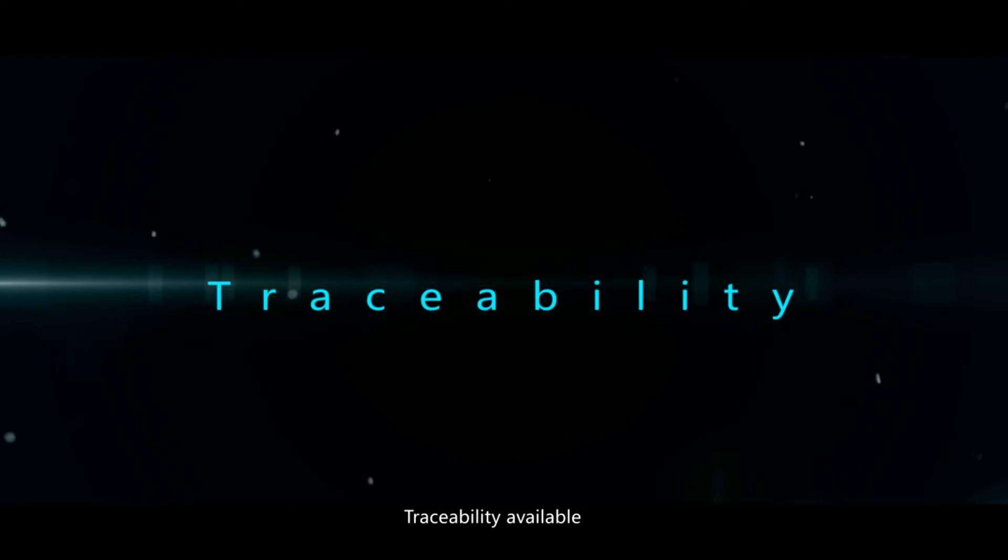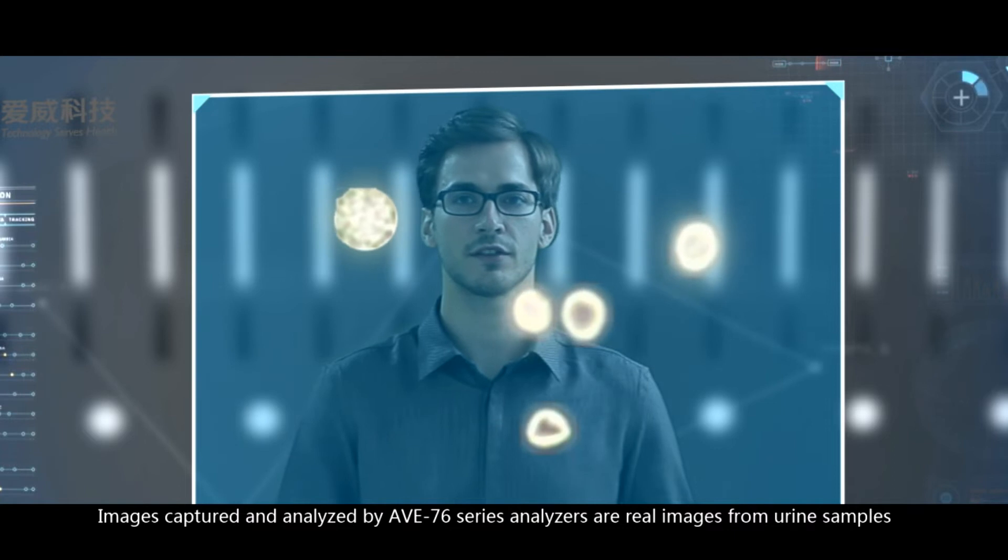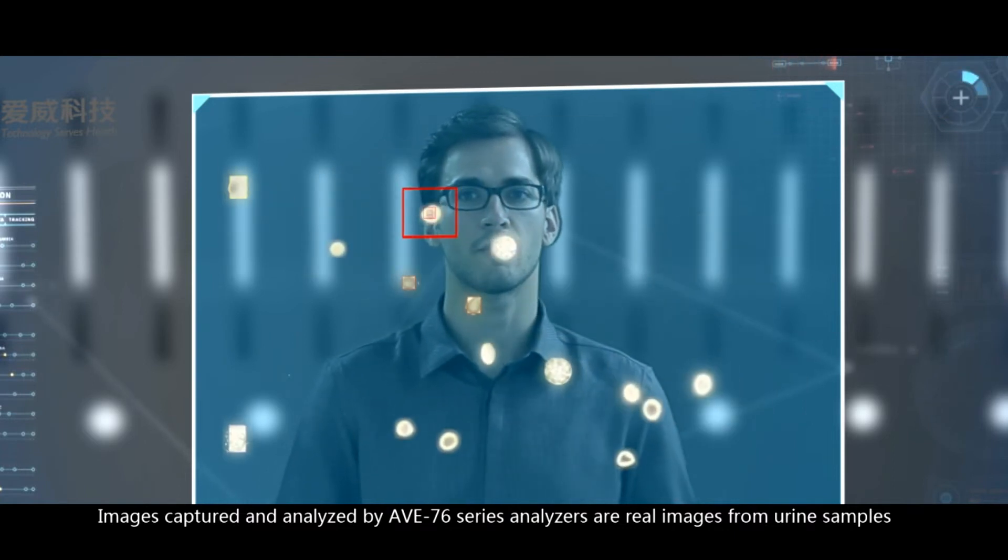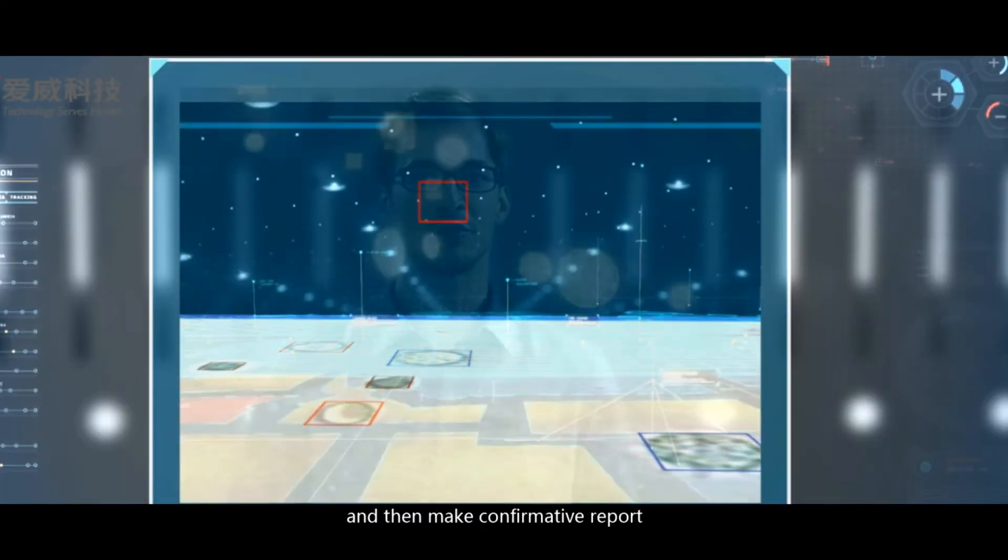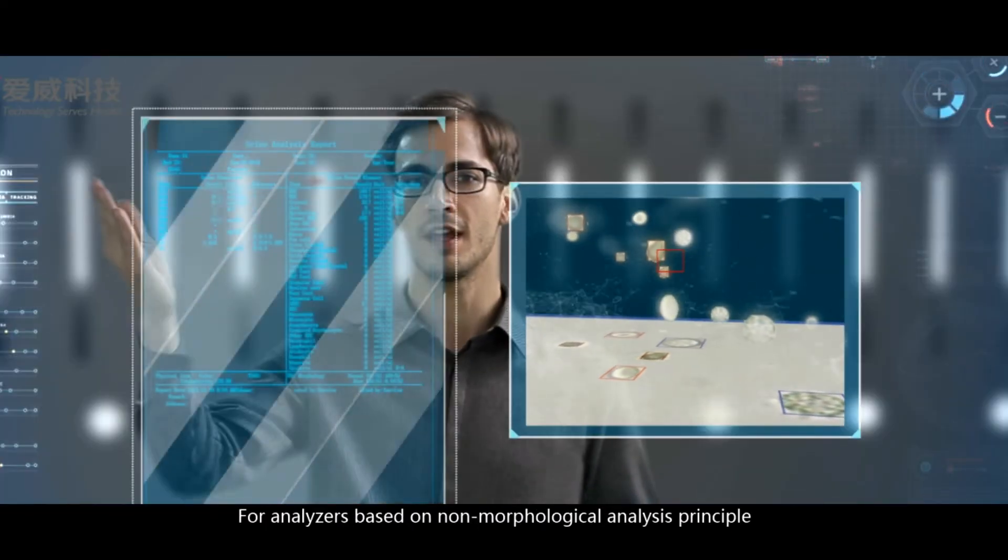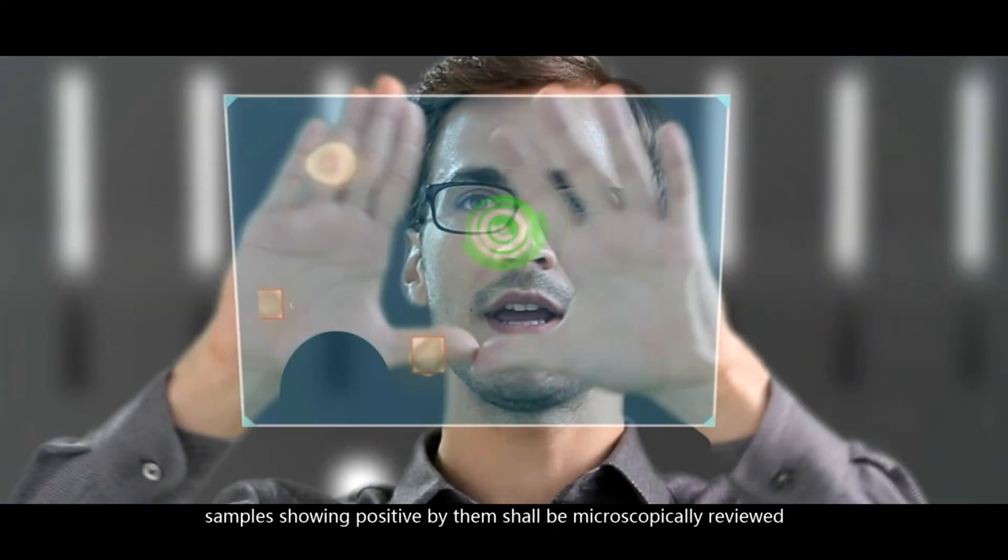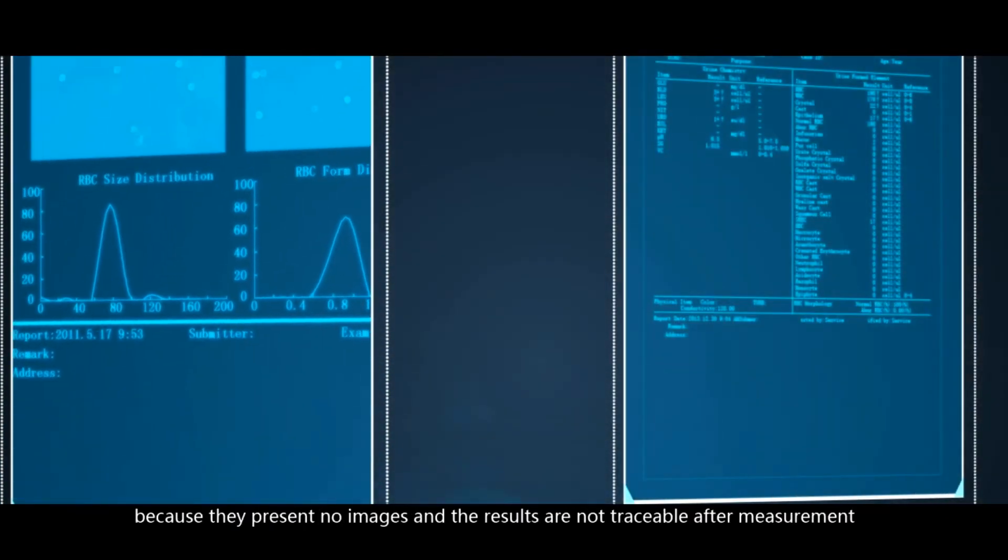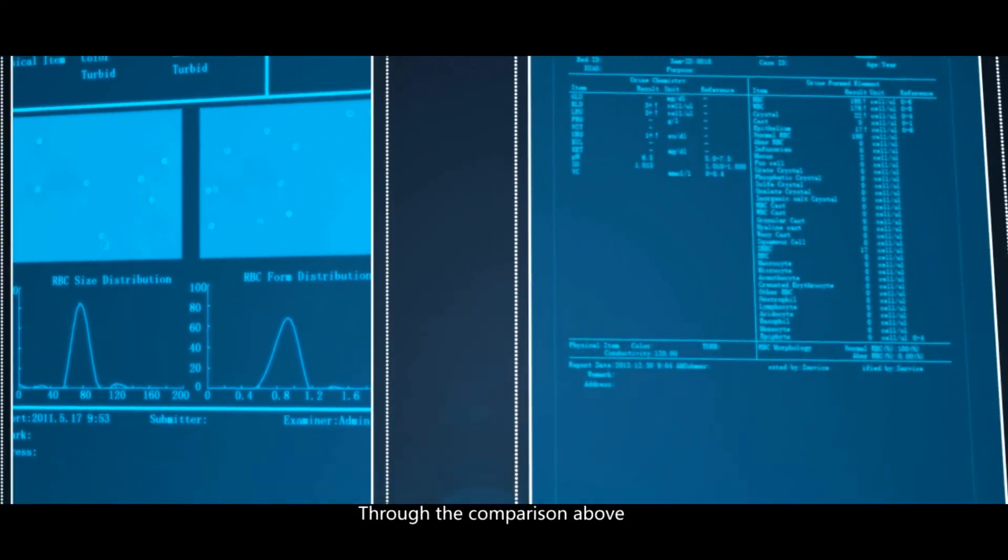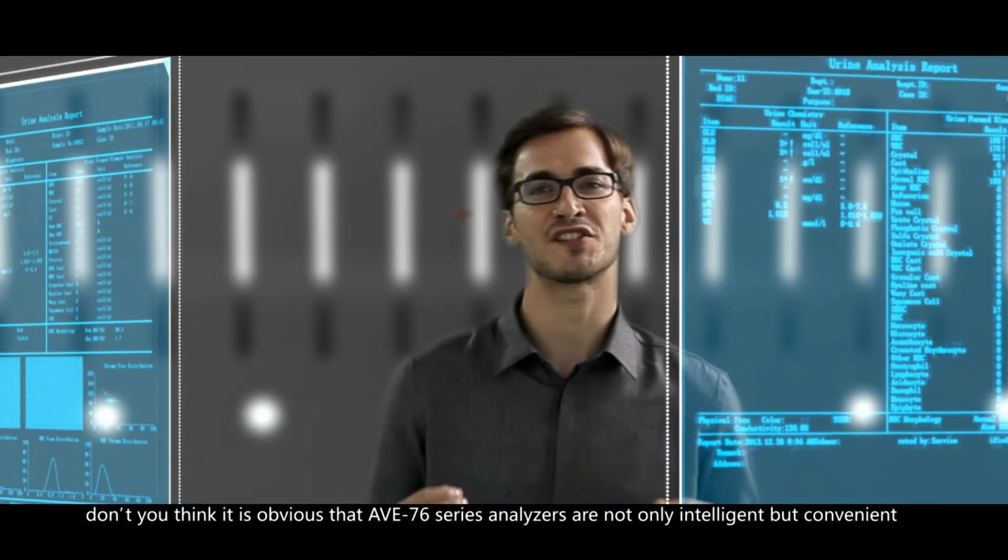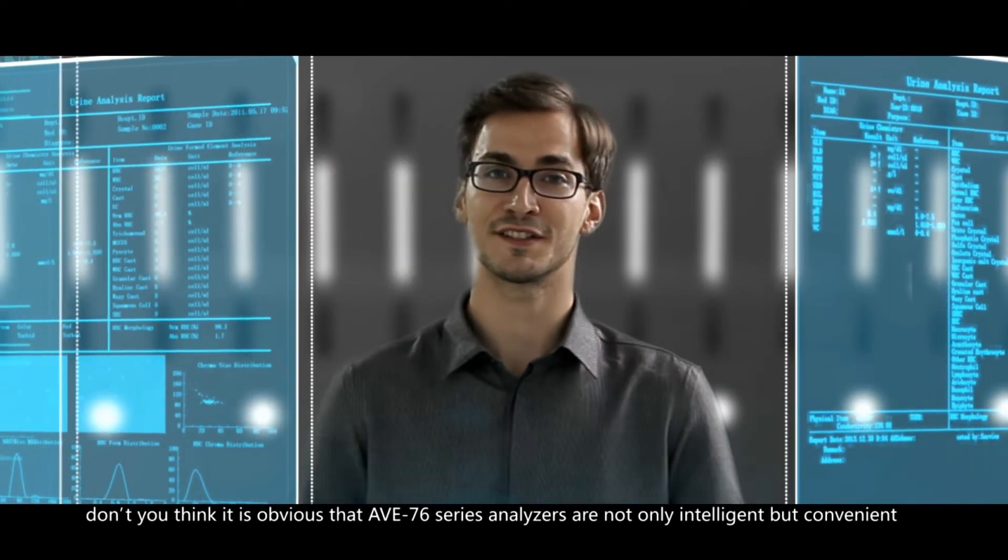Traceability available. Images captured and analyzed by AVE-76 series analyzers are real images from urine samples. You just need to review the suspicious targets presented on screen and then make a confirmative report for analyzers based on non-morphological analysis principle. Samples showing positive by then shall be microscopically reviewed because they present no images and the results are not traceable after measurement. Through the comparison above, don't you think it is obvious that AVE-76 series analyzers are not only intelligent but convenient?